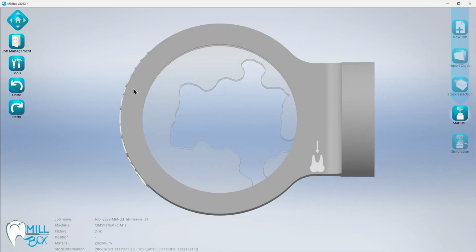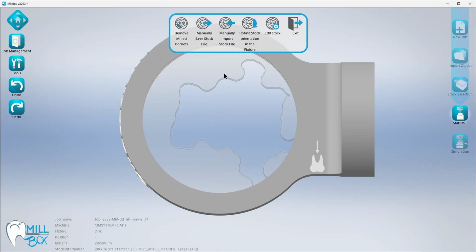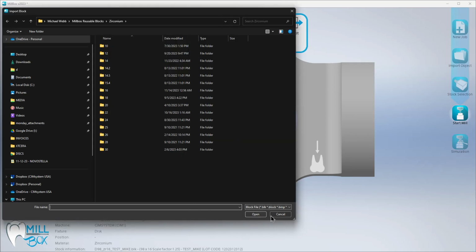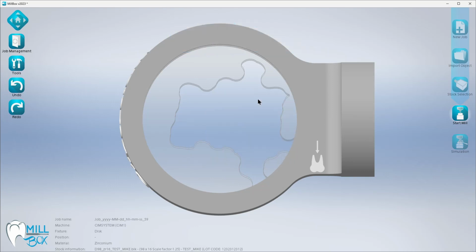You can actually go through and do this for all of your disks. Basically, as you're creating them, you just go back to the reusable stock, and then you go to manually export, manually save the stock file. Now this stock file is saved in the stock library, and then now you can just simply go to manually import your next image and then kind of continue down that same process. Of course, I did not select that file, so that's why that probably occurred there. So anyway, hopefully this helps you resolve that issue.